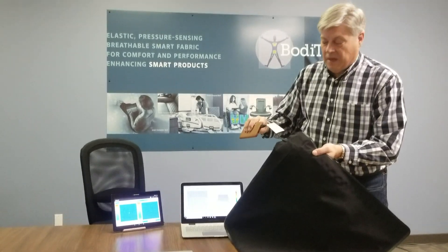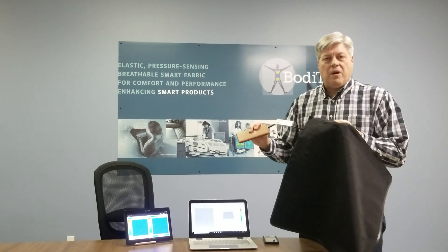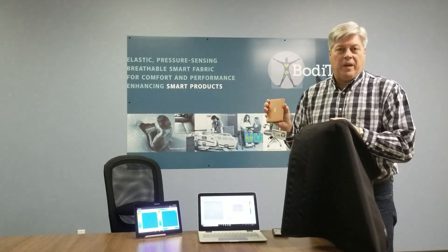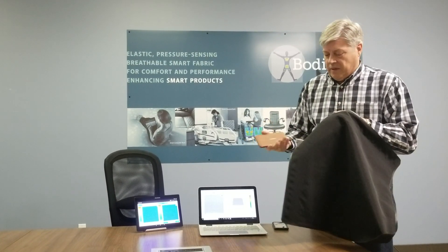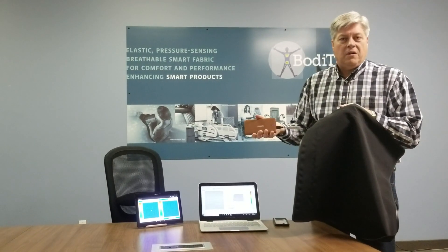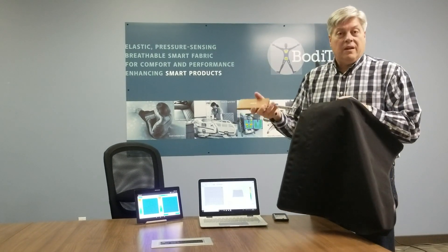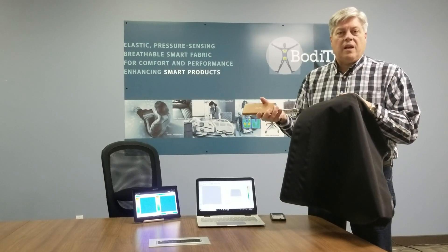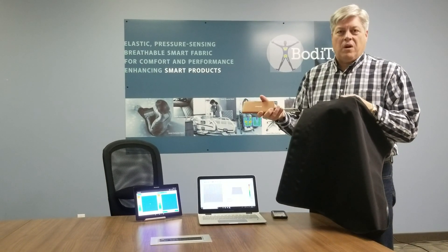There's still a USB cable coming out, but in this case, instead of plugging it into a computer to get your power, I've actually plugged it into a power box — or power bank, depending on what you want to call it — a lithium battery. You'll usually get a couple days of work on one battery with a seat mat. You can still plug a BodyTrack 2 seat mat directly into a computer and use it as you have with a T7, but it really shines as a wireless device.